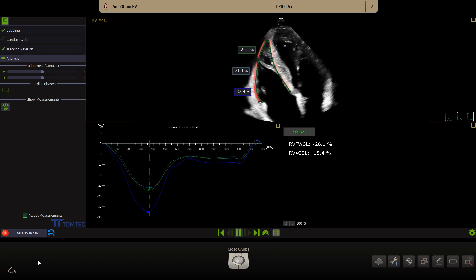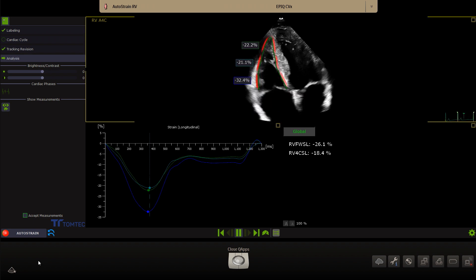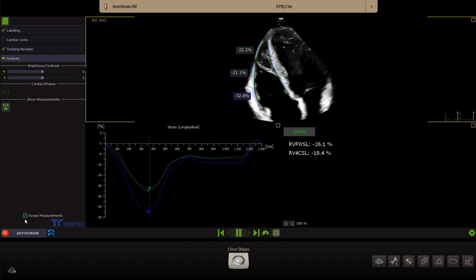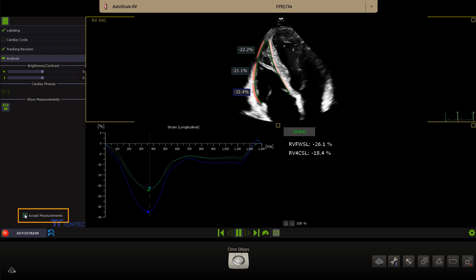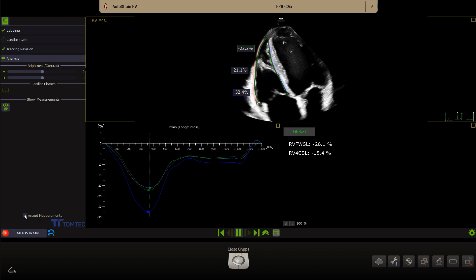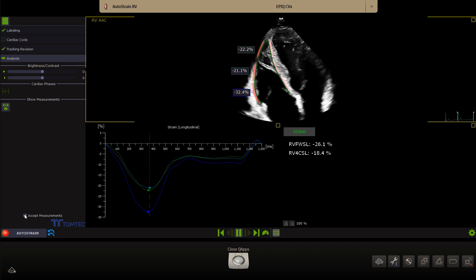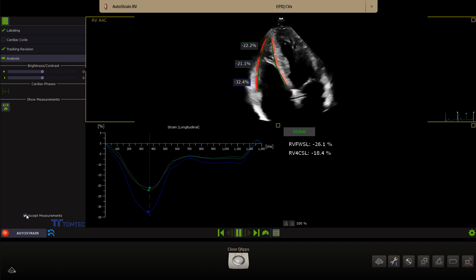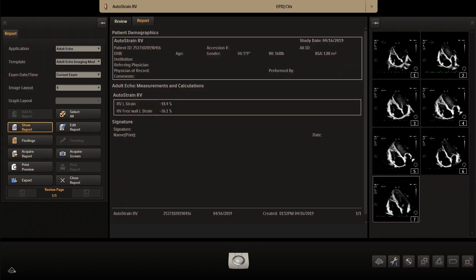When satisfied with the results, click Accept measurements to end the right ventricle auto strain quantification. The results will be exported to the report and DICOM structured report.